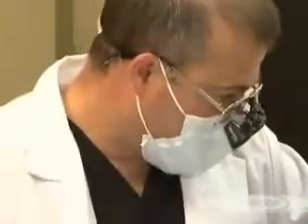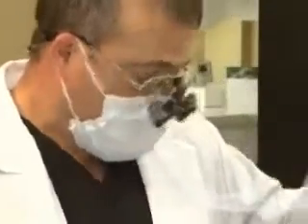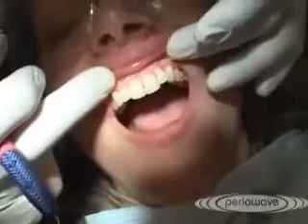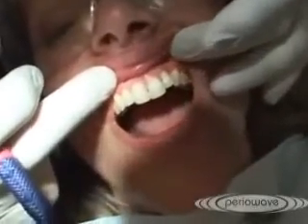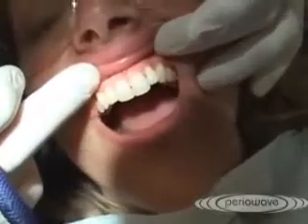Our patient is back after three weeks of post-treatment. Three weeks ago, we did some scaling and root planing in conjunction with PerioWave. After three weeks, improvements to the gum area are noticeable.